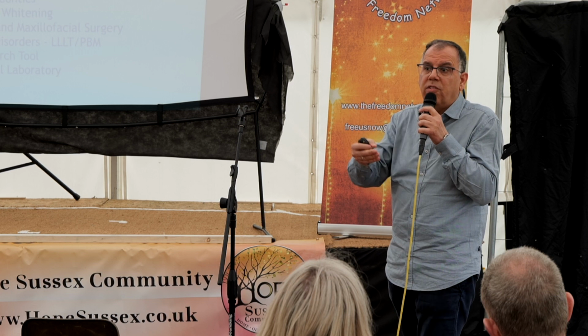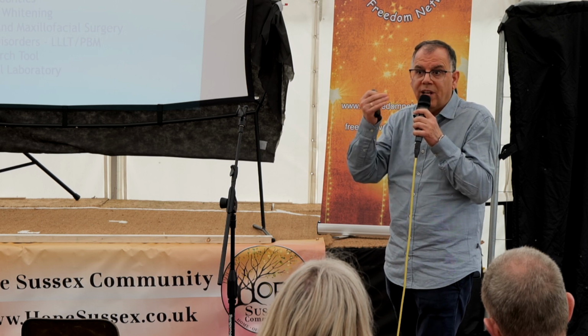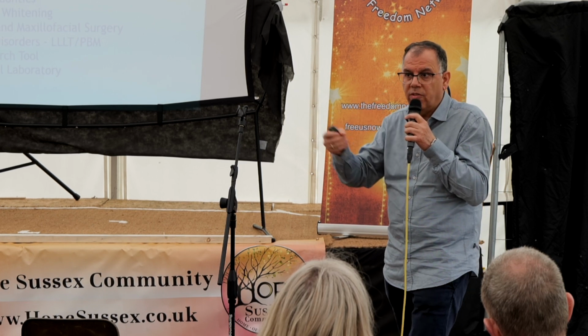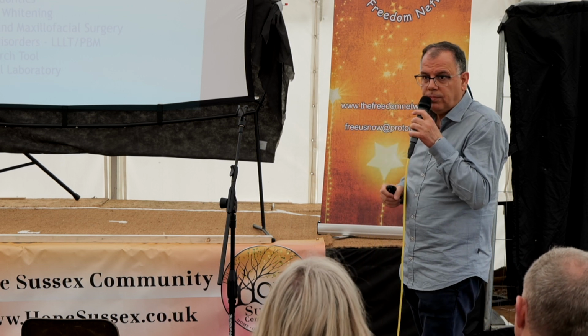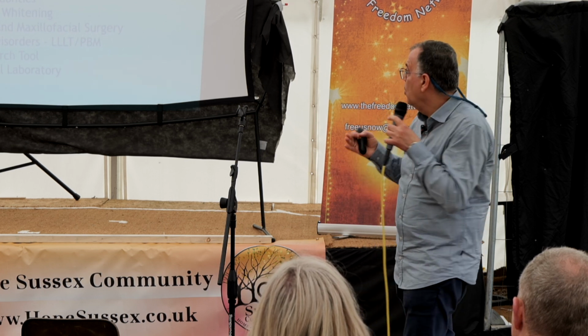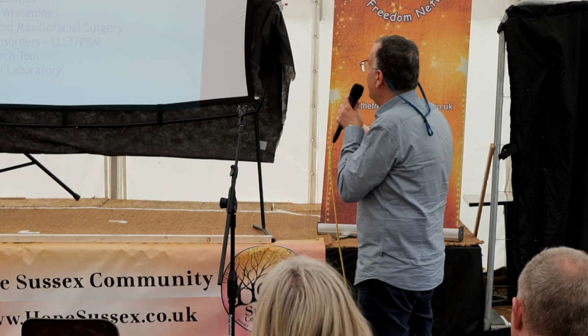it sterilizes the area of bone after the extraction with laser, with erbium laser mainly, and regenerates the tissue. It will help stimulate the regeneration of the tissue, and in 2 to 3 months, the healing will be unique, and we will not have the loss of bone that we would have with simple, ordinary, conventional extractions. Why? Because of the ability of the laser to stimulate tissue regeneration. This can only be done with laser, not ozone, unfortunately.